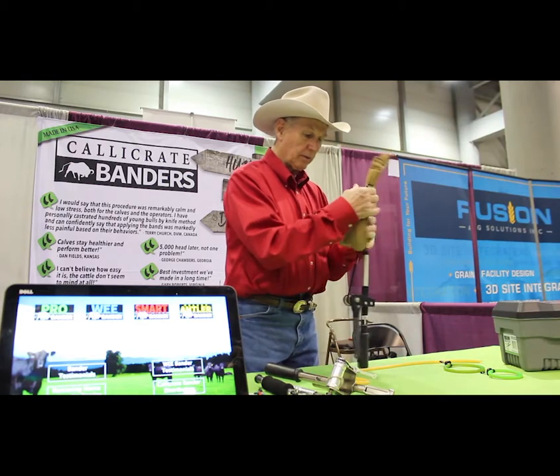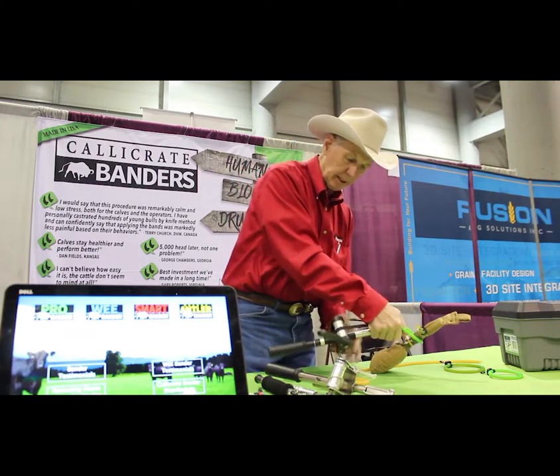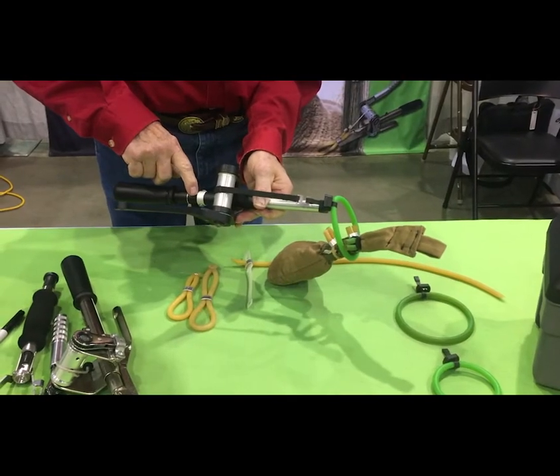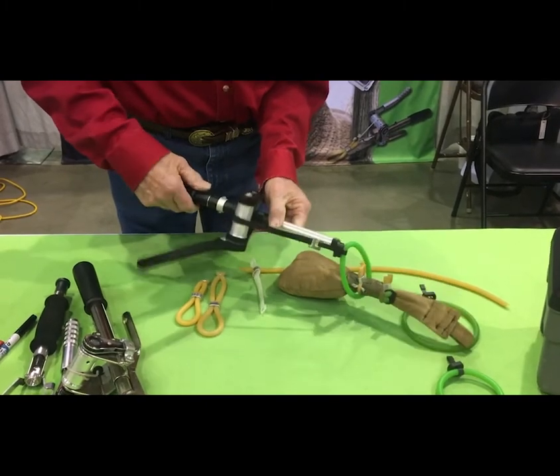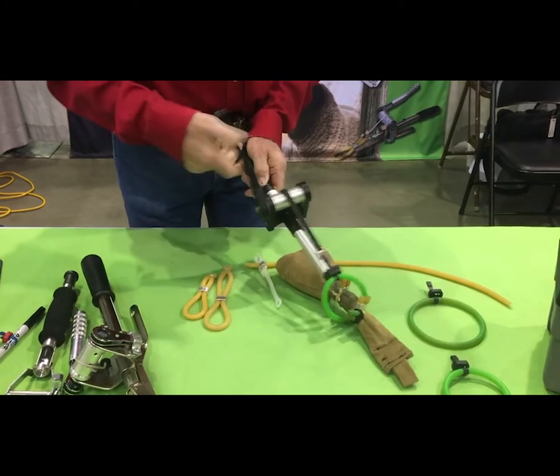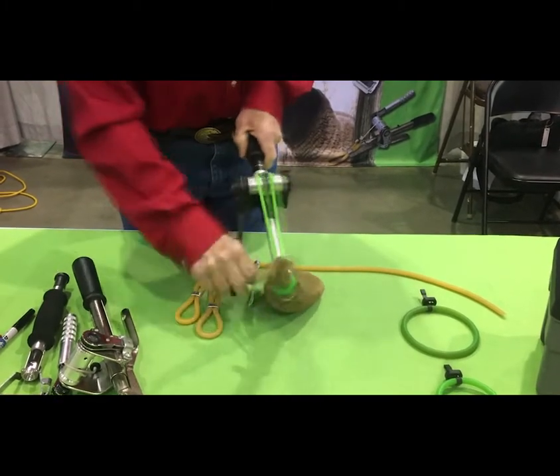So what we'll do is the same thing as we did with the other one, only this one the tension indicator is back here. This moves back to this silver ring. It's easy to see because you can see it in a full 360 degrees, and we'll tighten that exactly the same as we did the other one, and you can go just as fast.